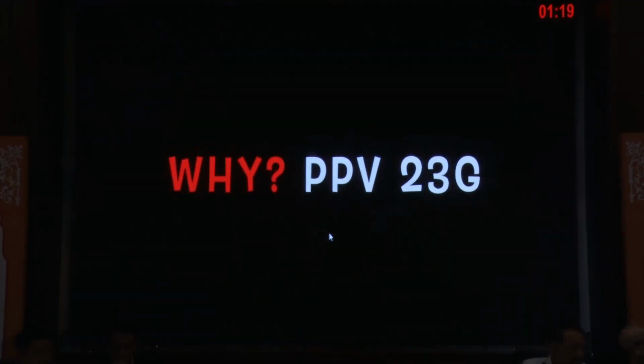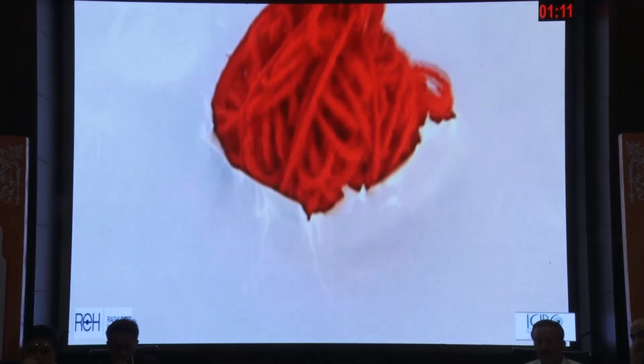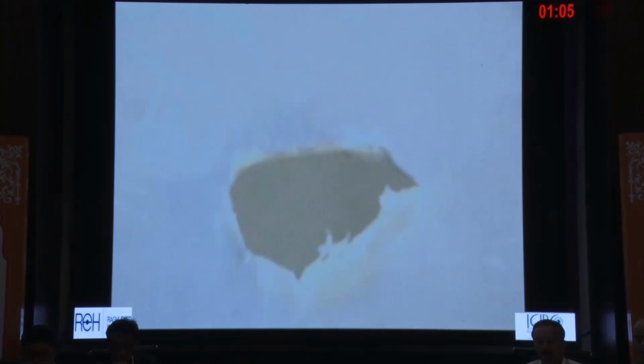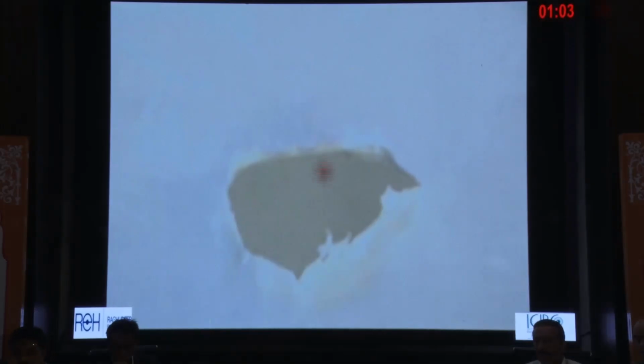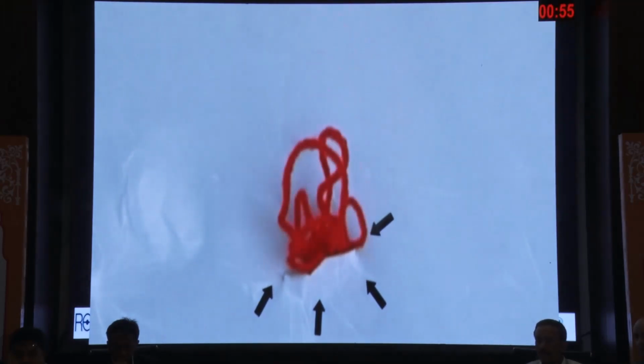So why pars plana vitrectomy again, this is a small video that I got from my friend Dr. Samresh from Raghudeep. This is the block where you're pulling the vitreous, no? Sometimes you can expand the PC rupture. But the same way, when you're doing the pars plana approach, you're actually pulling the vitreous back inside. So that way it is safer and there is less vitreous to cut, as you can see here, the vitreous strands that are prolapsing. And sometimes when you cut that, the things that are coming through the side port also come away. So you can clear the vitreous in the side port also.